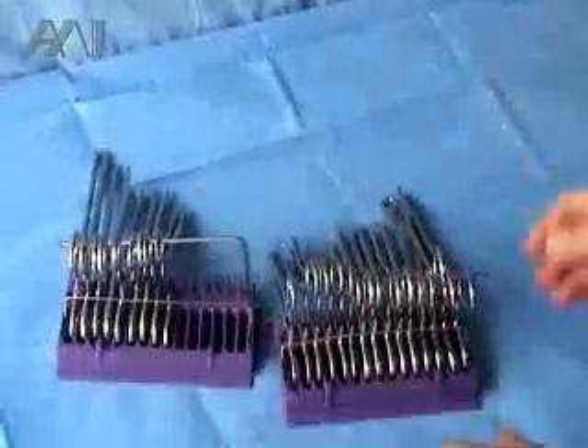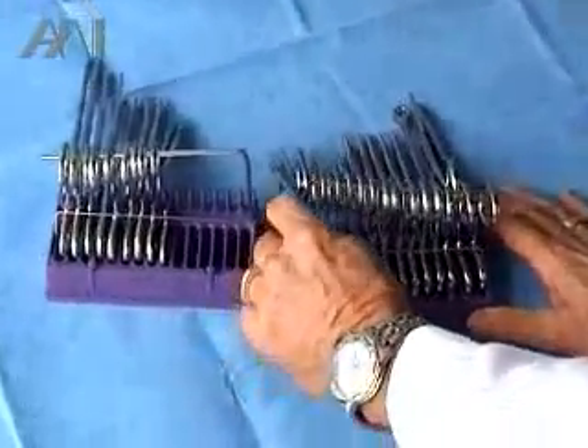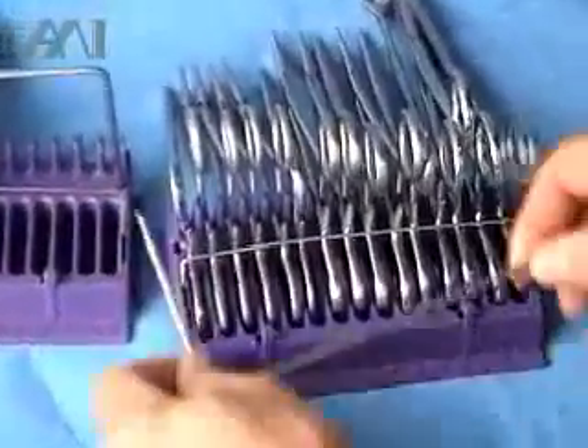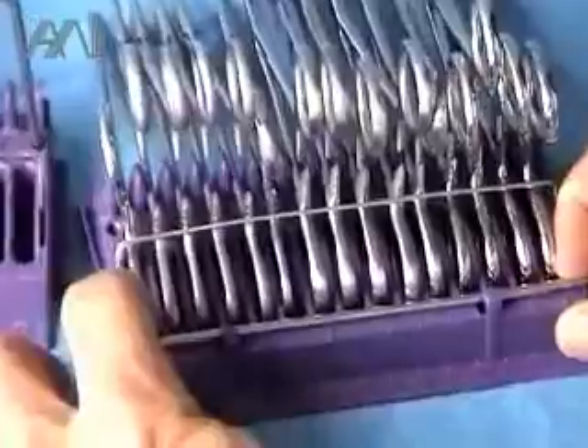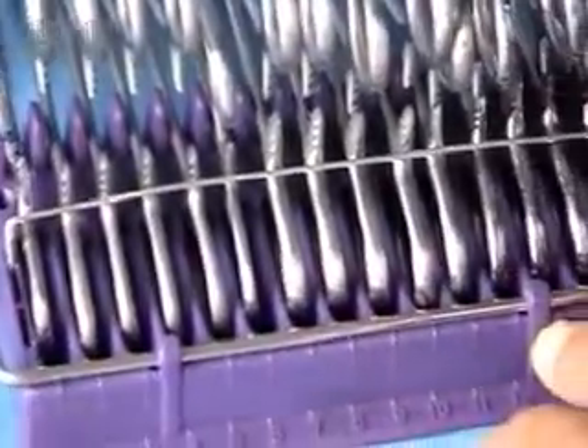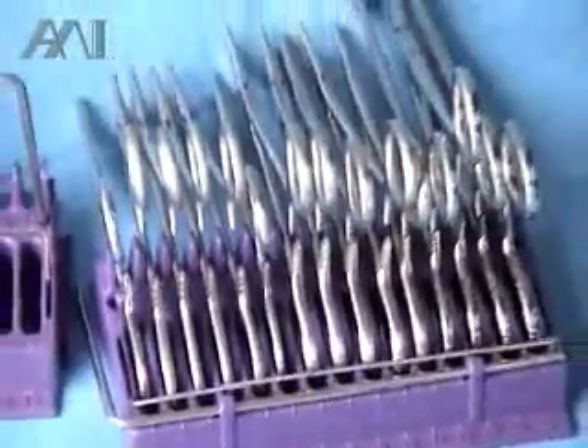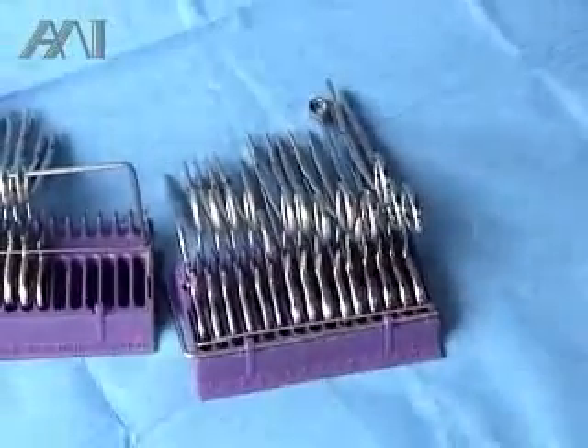When the instrument tray is opened up, the first step is to take the L-stringer off. To make sure you don't lose the L-stringer, we have an area with a couple of snaps here to contain it so it doesn't get lost. You then move the wire back, and the instruments are ready to be handled in the sterile field.